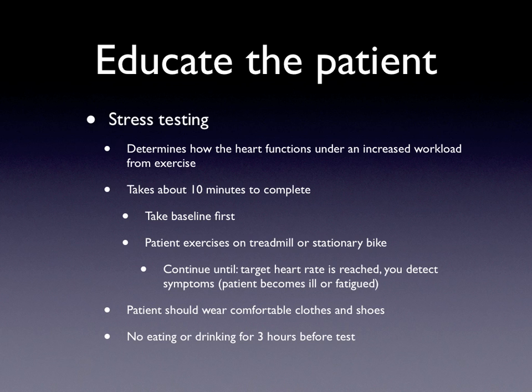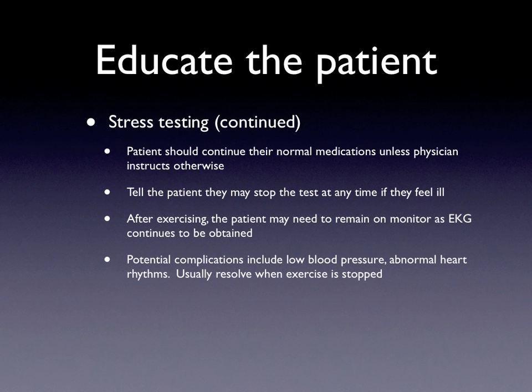Generally, and again, this is straight out of the study guide for your national certification test, no eating or drinking should be allowed for 3 hours before the test, but your work site may have different standards for that. Continuing on in stress testing, the patient should continue their normal medications unless their physician instructs them otherwise. So in other words, if they're coming in for their stress test at 10 in the morning and there are medications they usually take at 8 o'clock, they should have taken those unless their physician told them not to.